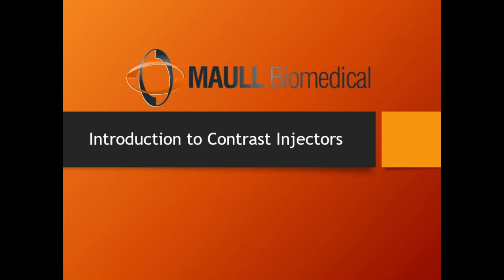The fluid in this syringe is called contrast. Contrast blocks X-rays, and I'll talk about that in a little more detail in just a few minutes. But during the actual X-ray image, whether it's an MRI scan or a CT scan or an angiographic procedure, we're going to fire the fluid into the patient while the X-rays are passing into the patient, and that will cause those blood vessels to show up on the images.